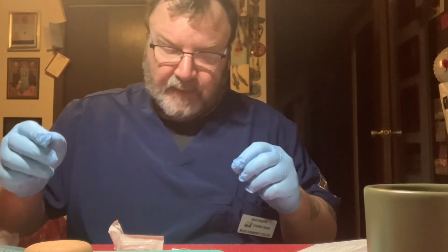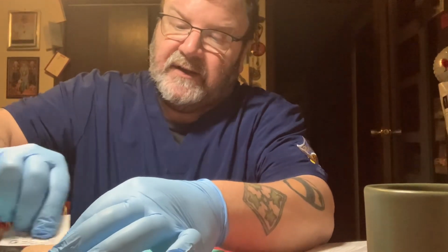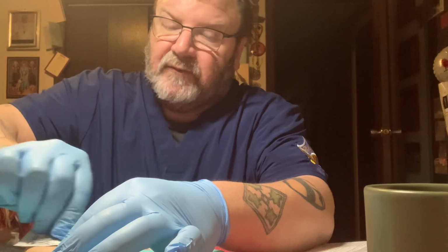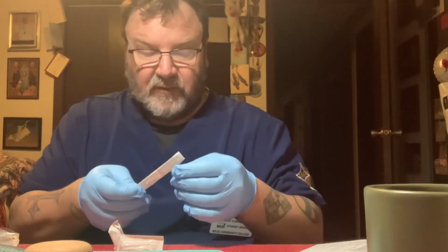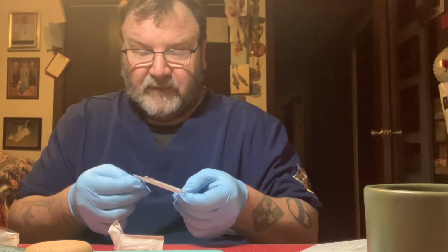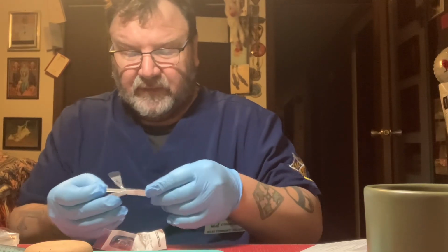Explain to the patient what I'm going to do. Okay, so now I would take the alcohol swab, begin in the center of where I'm going to administer this to the patient. Get that clean. Now I've touched the patient. I'm going to switch, so I would change my gloves, hand hygiene, put on new gloves. Now I'm going to switch to the needle, and the reason I'm having to do this is because of an equipment problem here, appropriate for the demonstration.